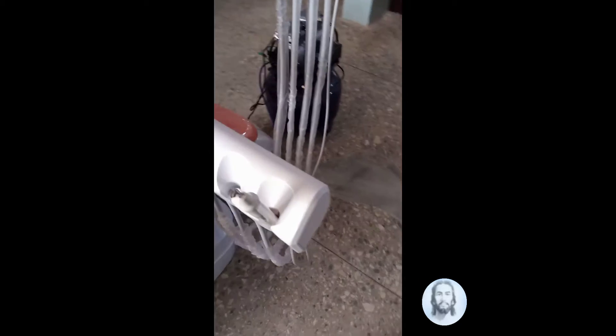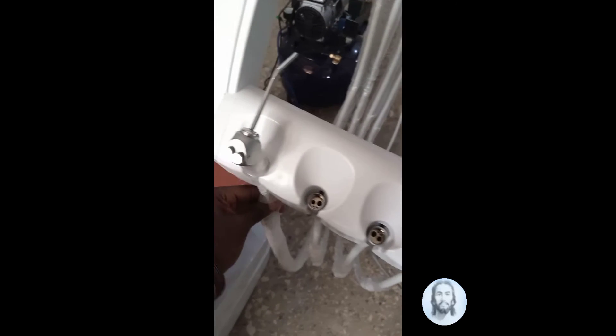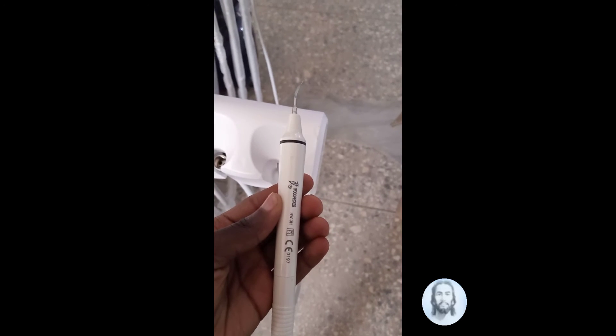Here again we have various nozzles: here is the water and air injector, and this is the ultrasonic scaler for scaling and polishing.